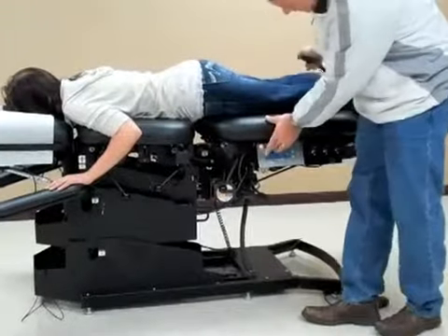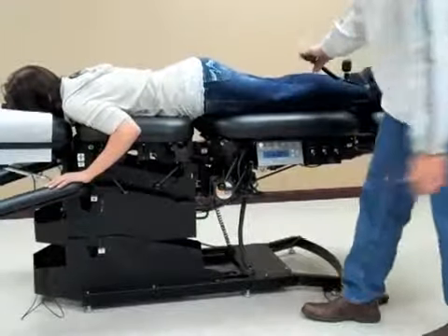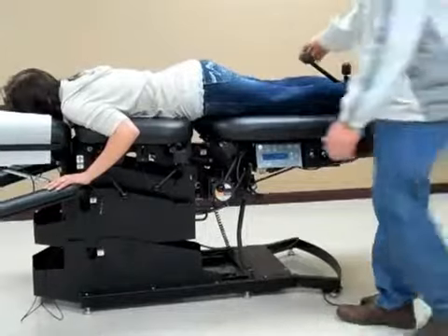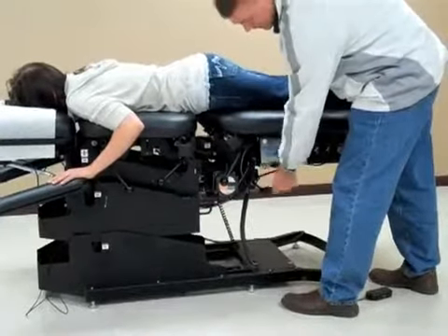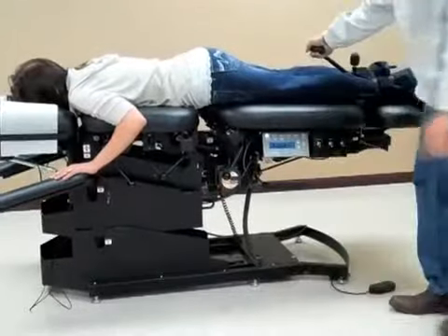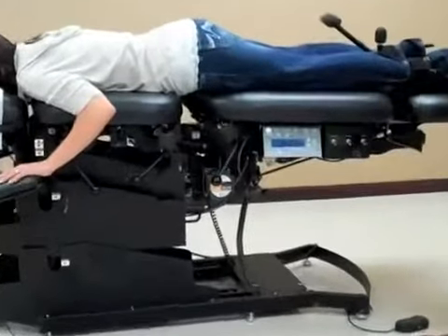To stop the table, I'm just going to hit the start-stop switch here. To disengage the table, I'm going to change the locking handle to the back end of the table.